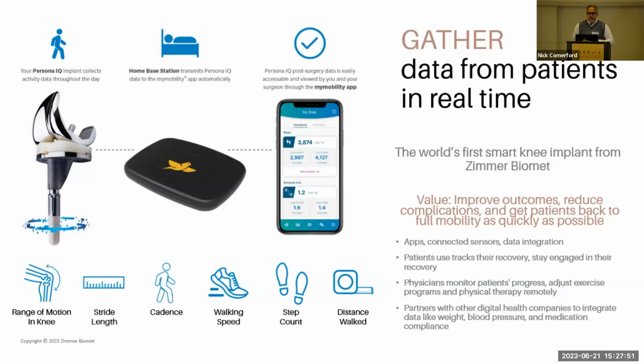Shown on the screen are some of the measurements, some of the data that's actually recorded from that smart knee. Now, from a human factors perspective, the thing that's very interesting, because I've run into this firsthand at both Zeiss and Proximie, is not anything related to the knee implant. It's also nothing related to the app. UX folks know how to design mobile apps and customer portals.